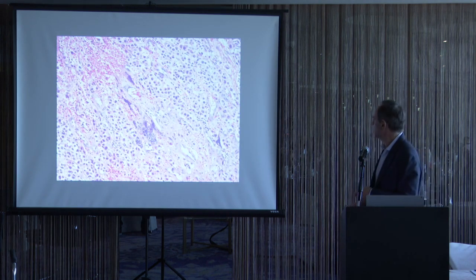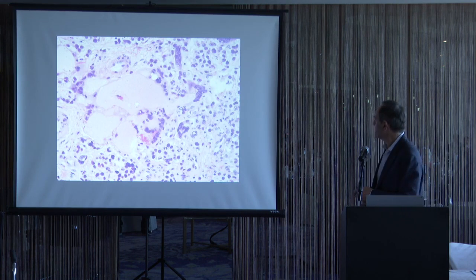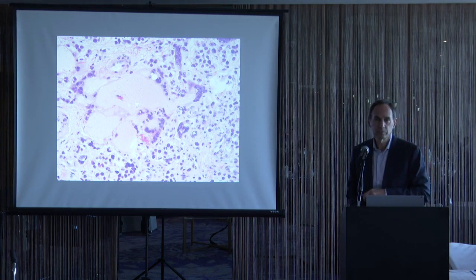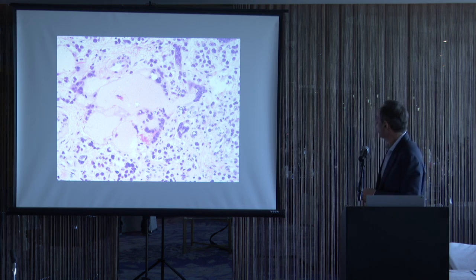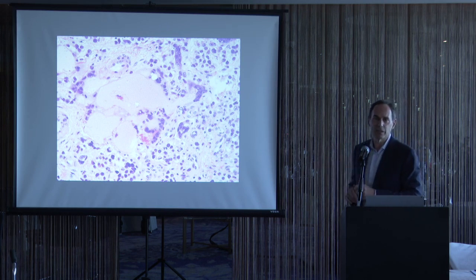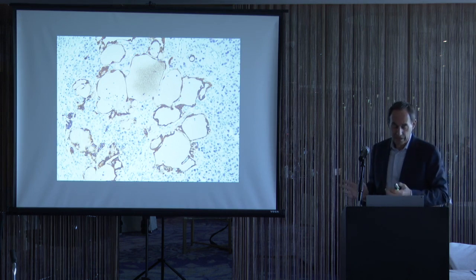Here's a case of syncytial trophoblasts encircling blood vessels, and that's, again, where they commonly are seen in a seminoma. Here we see another case where we have blood vessels and these syncytial trophoblasts encircling these blood vessels. So this could be considered vascular invasion? No, I wouldn't call that vascular invasion. They're basically more rimming the outside of the vessels as opposed to being in the vessels. This, I think, highlights that.